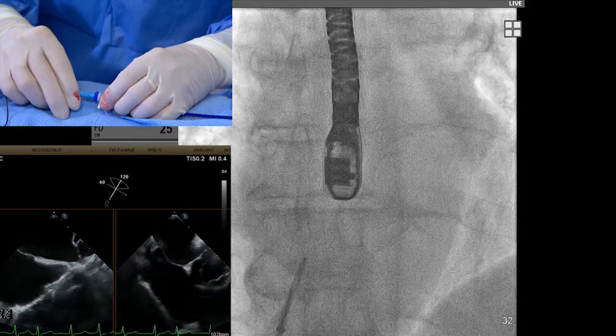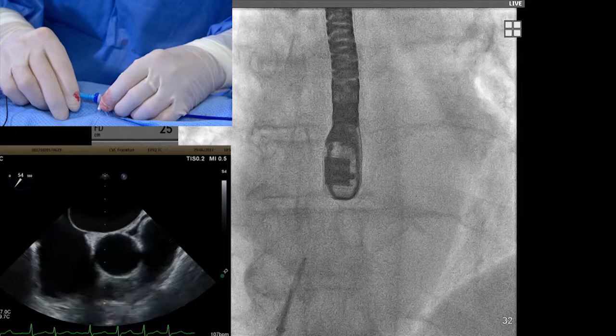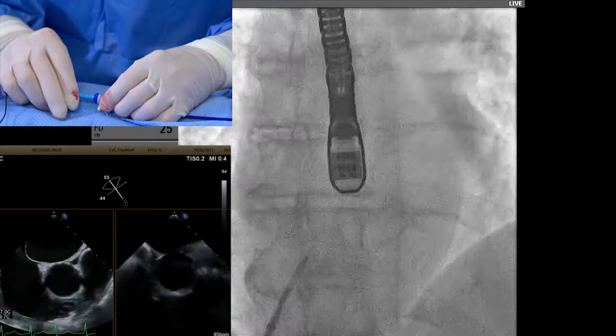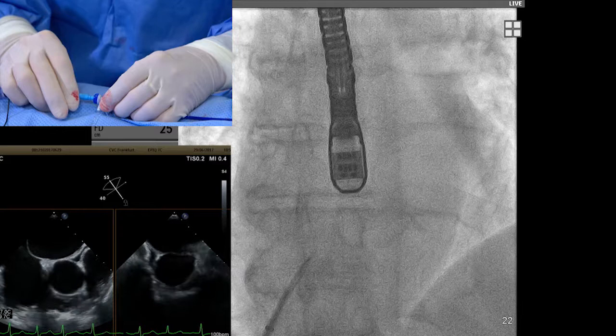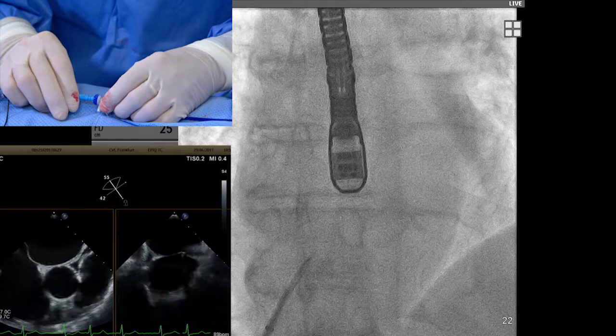Doing a final check. Using the long axis view on the left — the approximately 100-degree view — we can see the SVC and IVC, the fossa in the middle, and assess superior to inferior. The orthogonal view on the right is the short axis on the aortic valve, giving an anterior-to-posterior cut through the septum, helping to identify the posterior inferior region of the fossa for puncture.